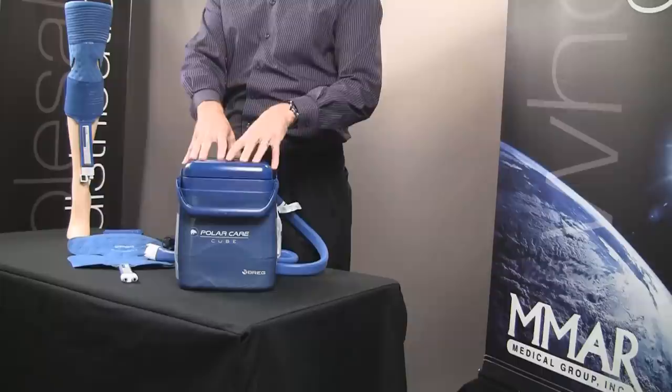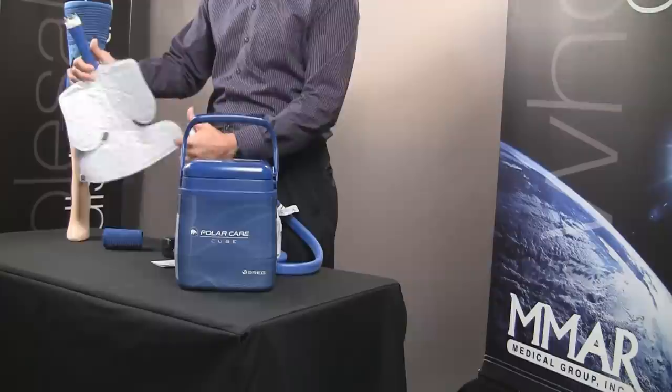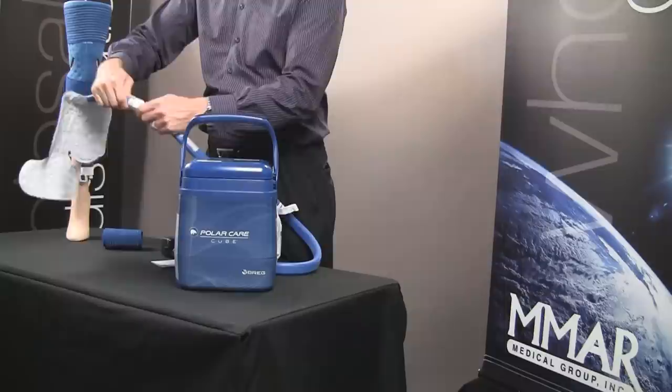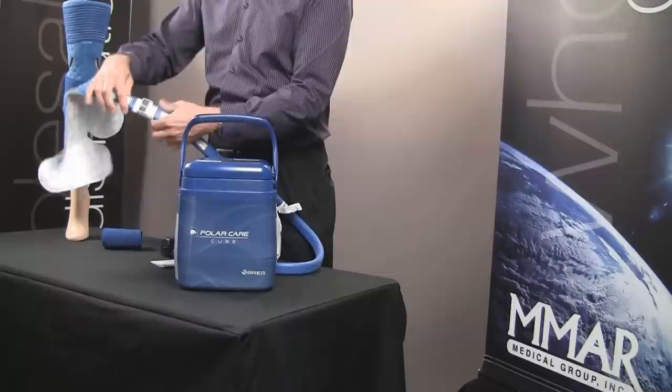Once you've put the ice and water in, put the lid back on and lock it into place. After you've wrapped the pad around the extremity or area of the body where the injury is, press the two silver couplings and pop it into place — you should hear a click. If you're having a hard time clicking it together, it might be because one of the couplings is not fully depressed. Make sure they're both pushed in to get a nice snug fit.